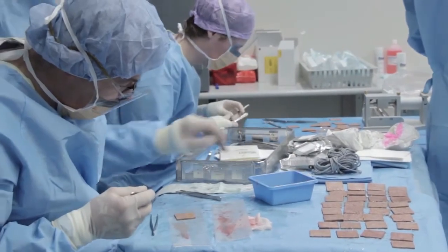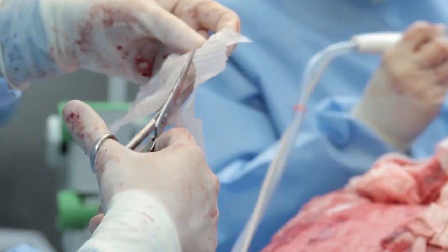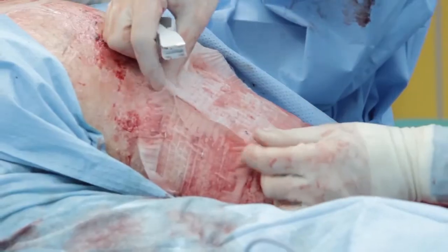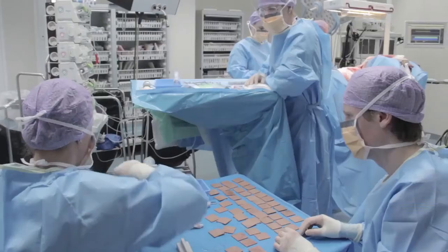The Meek method is a practical and reliable technique for obtaining widely expanded autografts, especially in cases of extensive burns. It is considered the most efficient method for dealing with the patient's skin.